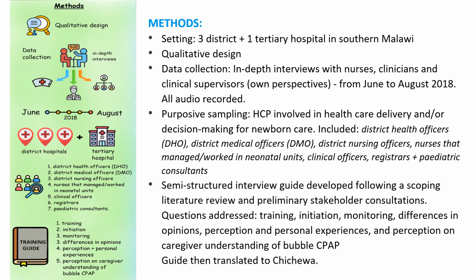The study was conducted in 3 district hospitals and a tertiary hospital in southern Malawi. This was a qualitative study where data was collected through in-depth interviews about the perspectives of nurses, clinicians, and clinical supervisors on working with bubble CPAP. Interviews were conducted from June to August of 2018.